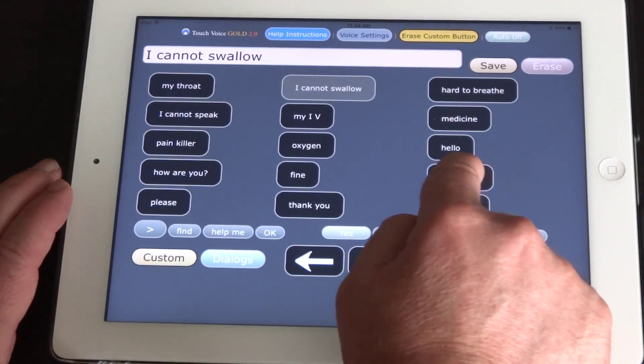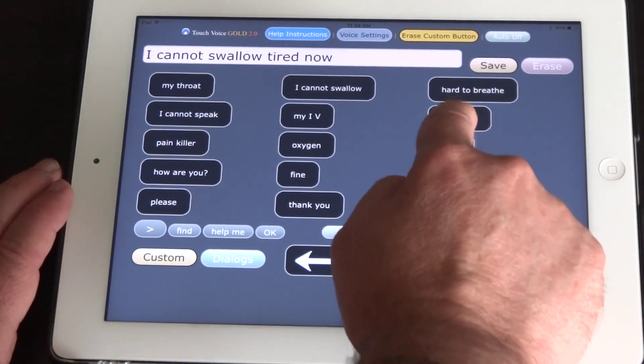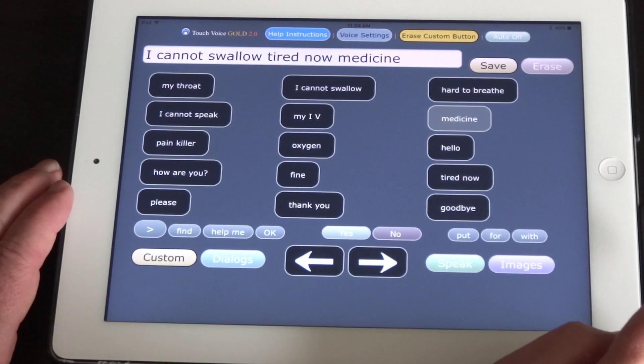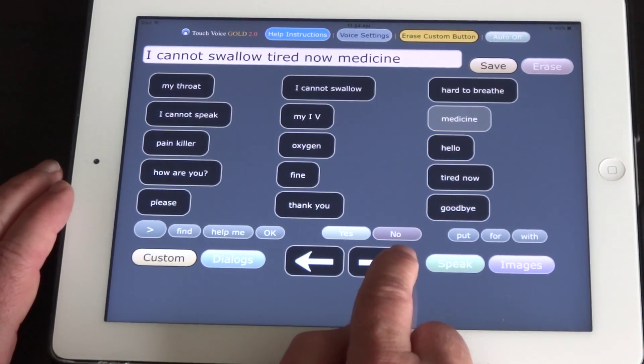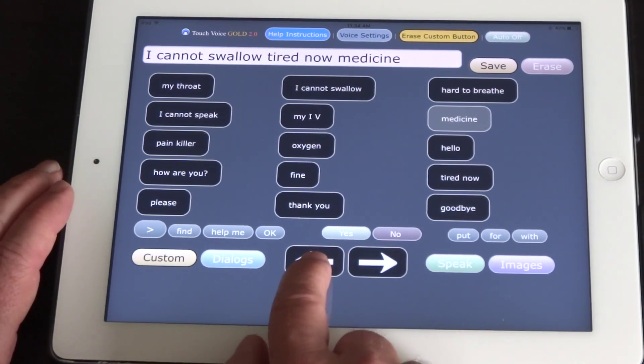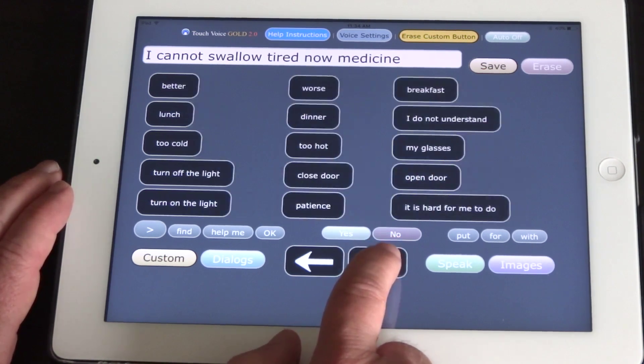I cannot swallow. Tired now. Medicine. Now page back with the other arrow key. When it reaches the end, it will page no more.